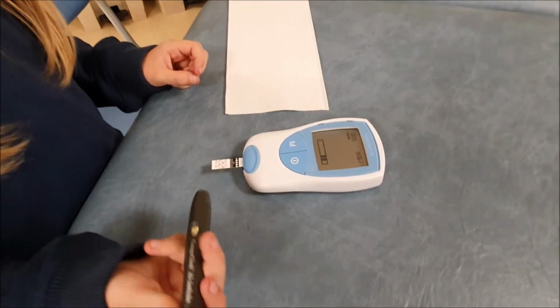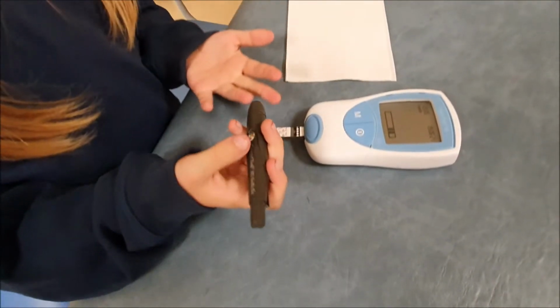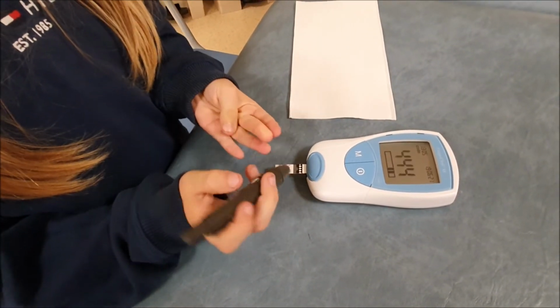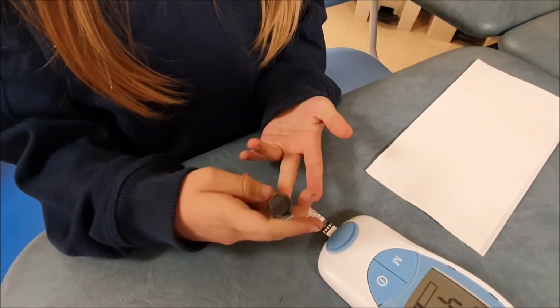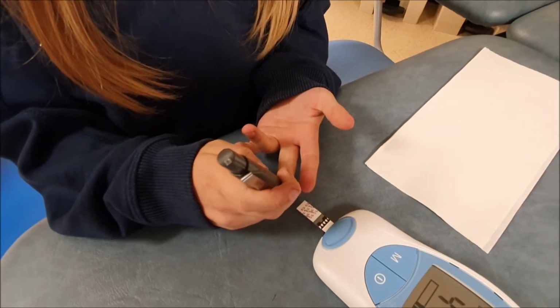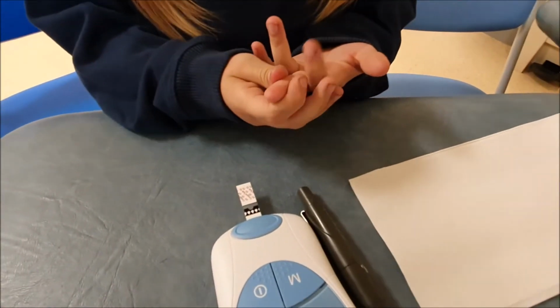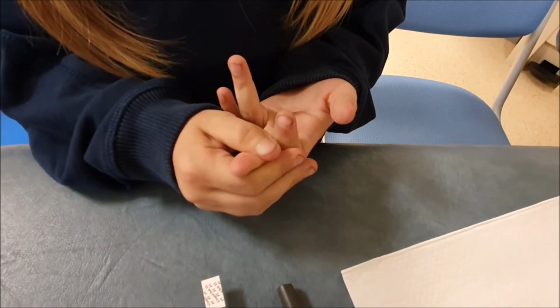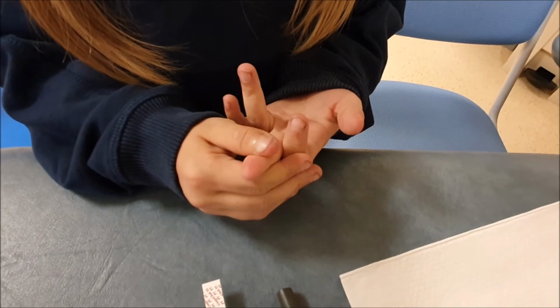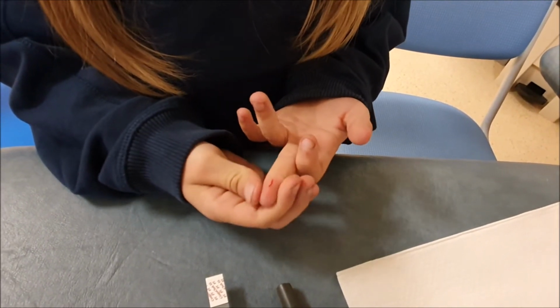And then get the little yellow button and then choose your finger, that one. And then put it on like that and then press the yellow button. And then if not really any blood has come out, then just carefully massage it, without touching it, till it comes out. Try not to touch the blood.